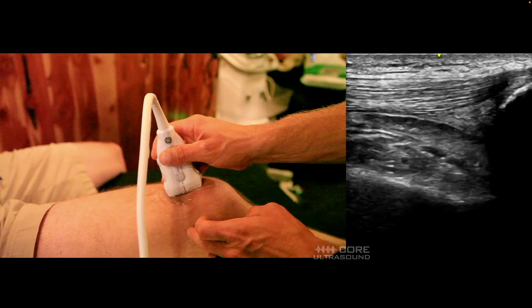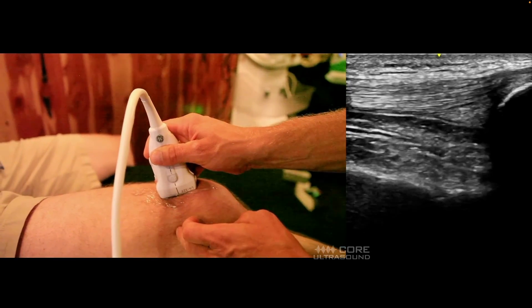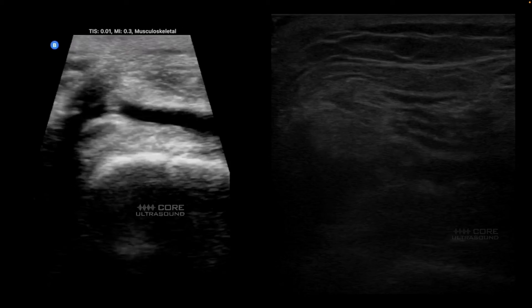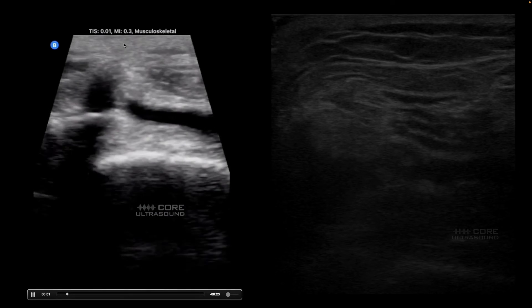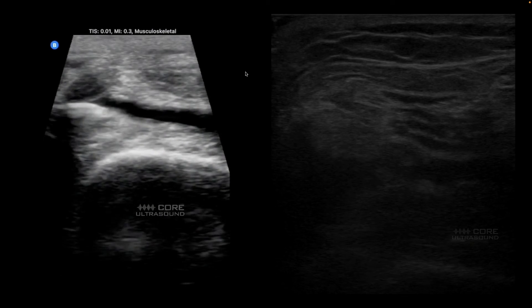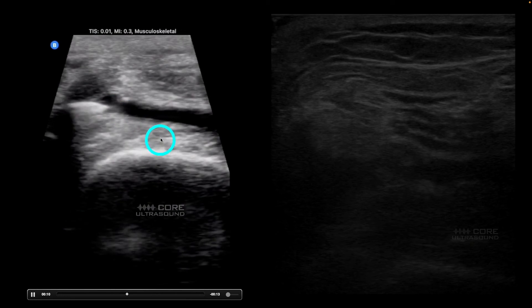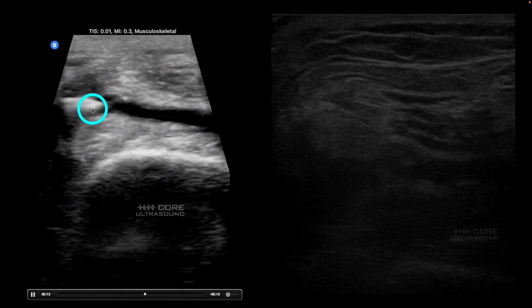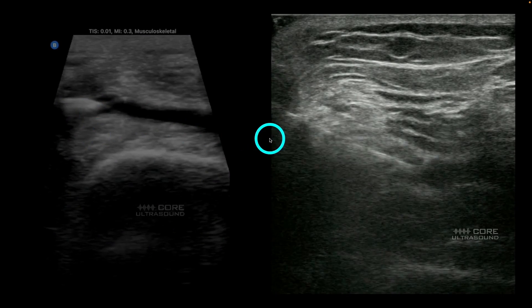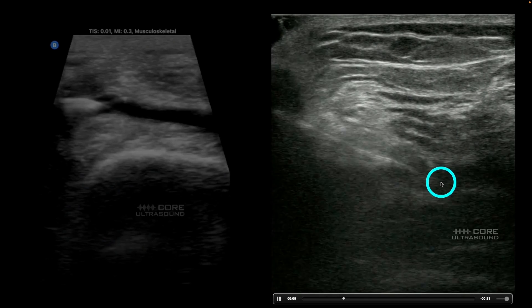The previous examples were more focused on aspiration, but it's the same technique with injection — you identify that suprapatellar space, turn your probe into the transverse orientation, and inject. Here are a couple of examples. You can see the needle coming in in the transverse orientation relative to the leg itself, with the needle in the long axis. Over here we see a similar technique using a smaller needle, probably 25 gauge, approaching the suprapatellar recess for injection.